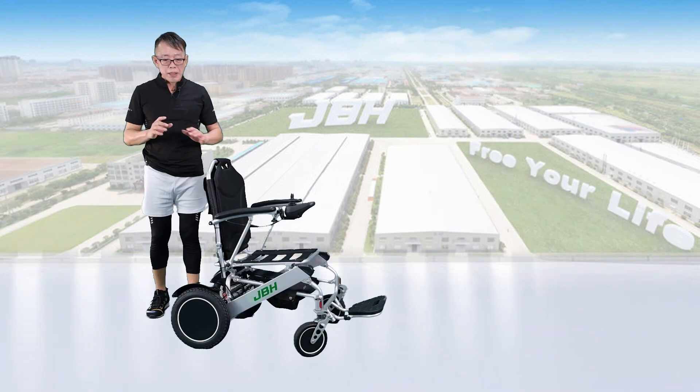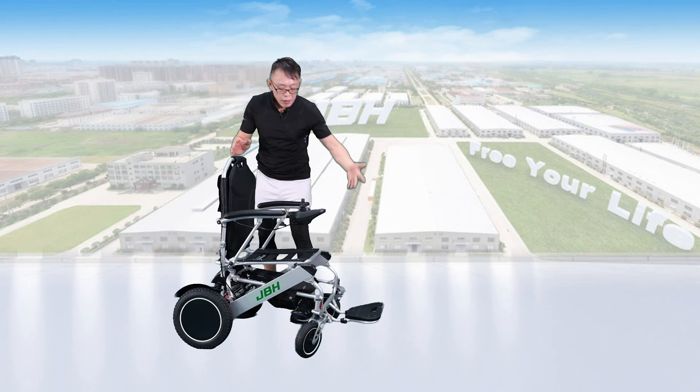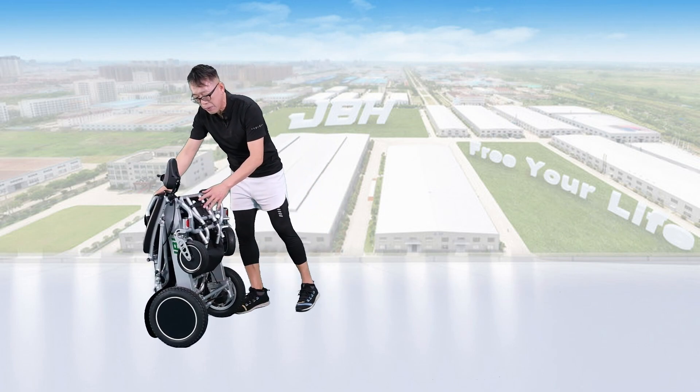Folding the wheelchair is really simple and easy. Just push the button here and lean the seat back forward a little bit. Then hold the frame under the seat and the top of the seat back, and we can close it in just one second.